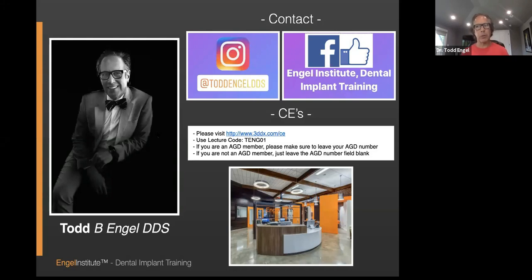Then you're going to place your resorbable membrane. And the reason that you want to do that is because you don't want to have to elevate tissue. The membrane should exceed the bony margin defect by 2 millimeters. And then we're good to go. The membrane will contain the graft. It will isolate the epithelial invagination. And in about 4 months, you'll have what you saw. Mine, I got in 3. Okay, hope that explains it.